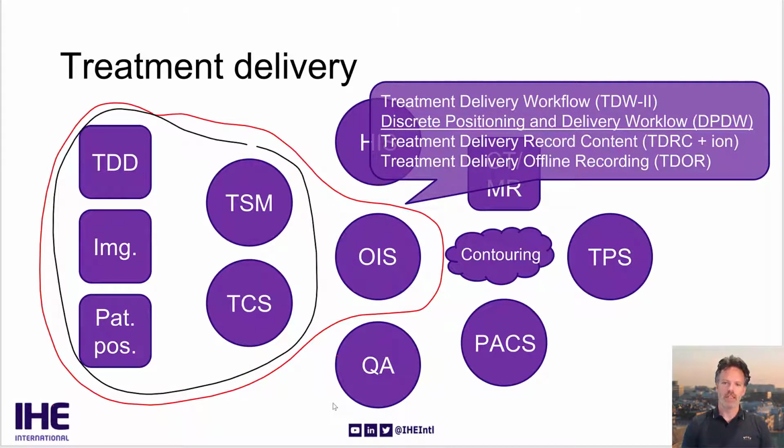There's then the more detailed, discrete positioning and delivery workflow. This is between the treatment session manager and treatment control system on the one side, and the actual devices in the treatment room on the other side. So this involves communicating separately with in-room imagers and patient positioning systems and treatment delivery devices.